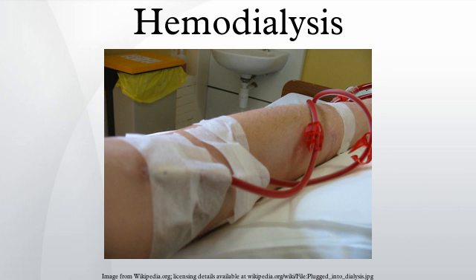Fistulas can also become blocked due to blood clotting or infected if sterile precautions are not followed during needle insertion at the start of dialysis. Because of the high volume of blood flowing through the fistula, excessive bleeding can also occur. This is most common soon after a dialysis treatment. Pressure must be applied to the needle holes to induce clotting.